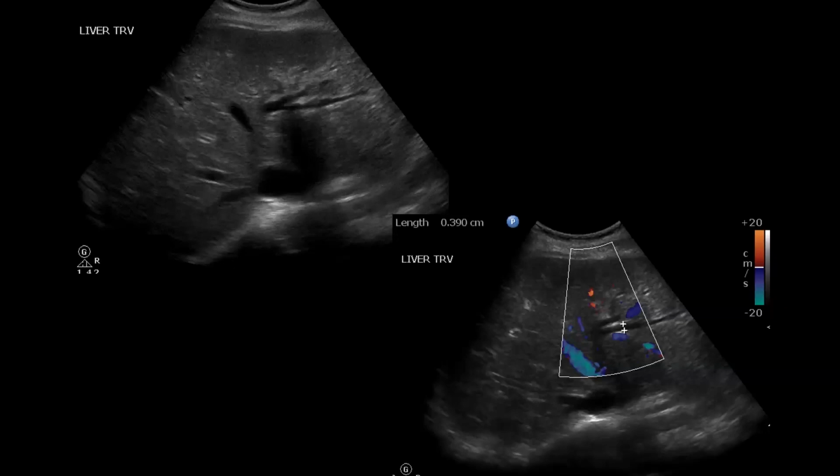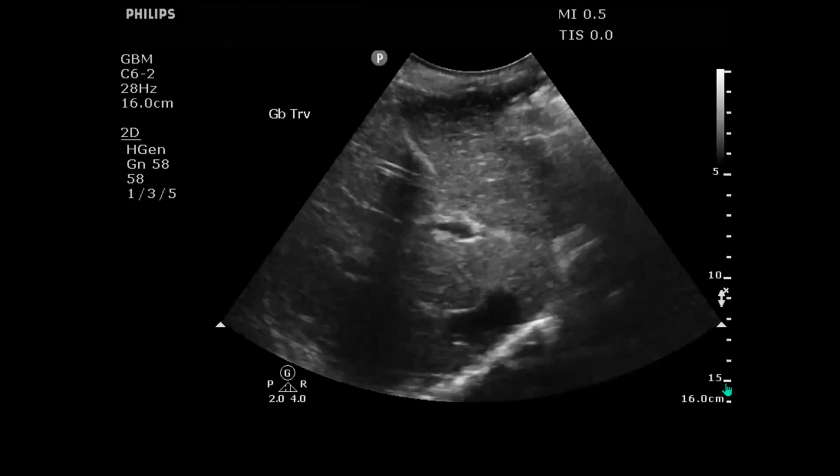And so you're like, wait, it looks like there's a vein above that, which yeah, there probably is, and it's a portal vein. There's not color flow right here, and I think that's just because you're right at 90 degrees to the probe, but you can see the color flow in this vein right there. So that little duct should not be that big.